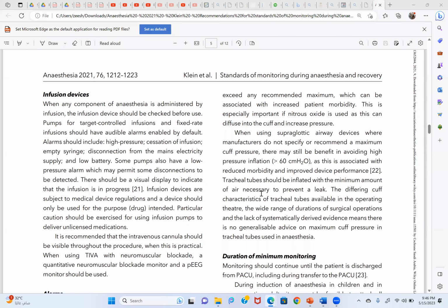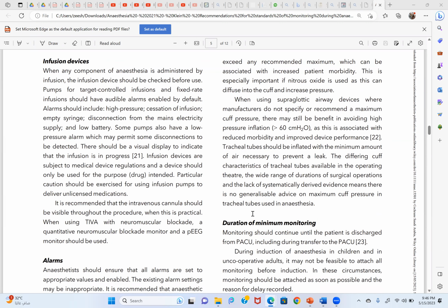I don't remember, I forgot the number. I think it is 15 or 10 PSIG. Please just check it out, how much syringe pressure you need. Of course, I have never used it, so I forgot. But I repeat, there is a specific pressure number which you need to monitor when you are injecting a medication, especially in nerve blocks, to avoid intraneural injection.